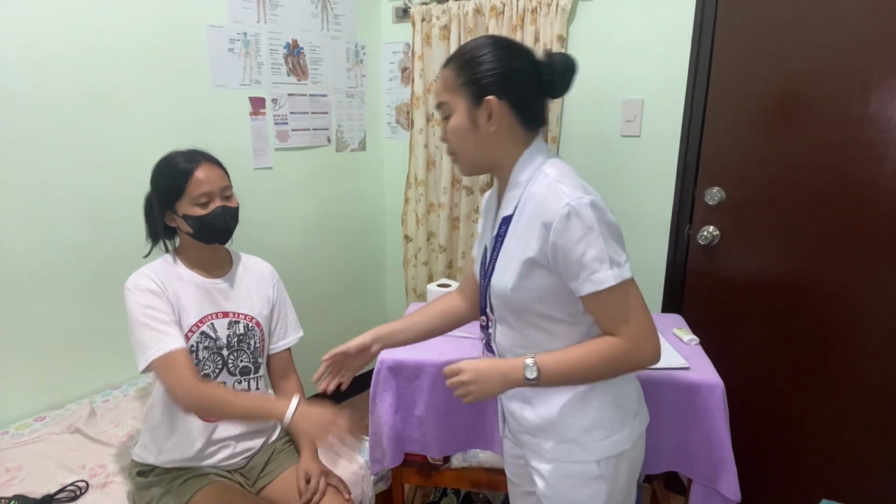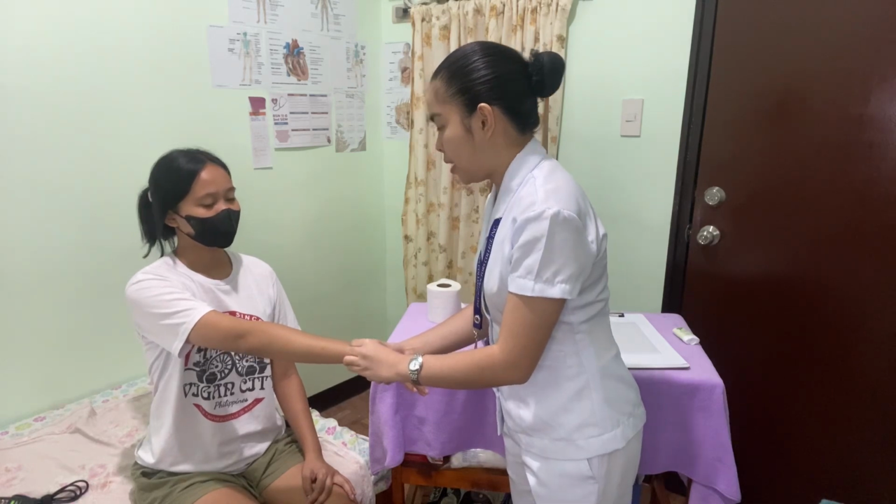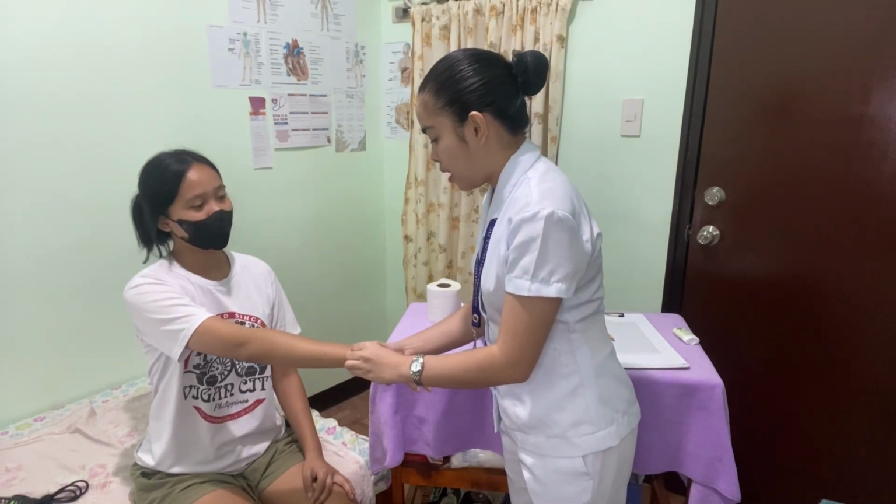So good morning, ma'am. I am Nikka Andrea as Pilas, your student nurse. May I see your wristband, ma'am? Please state your name. January Chair Udas. Your birthday, please. July 16, 2000. Oh, thank you so much, ma'am. And today I'm gonna be counting your respiration rate. So, is it okay with you, ma'am? I just need you to be at ease and be relaxed.